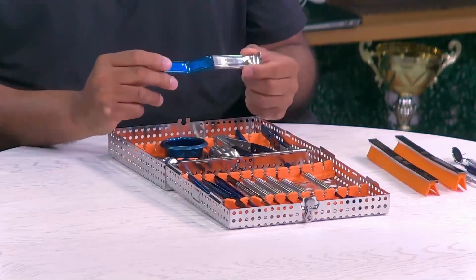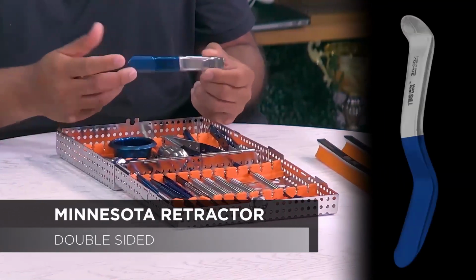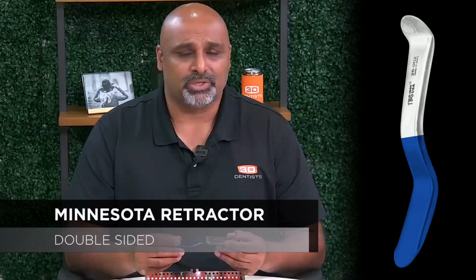We also have a Minnesota retractor in here. The Minnesota retractor, as you know, once you get into doing surgery, is helpful to retract lips and tissue and to keep your flap out of the way as well. So we do have a Minnesota retractor. You can use it on this end. You can also use it on the hook end to do your work there.